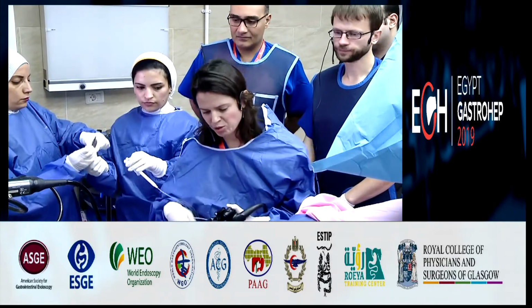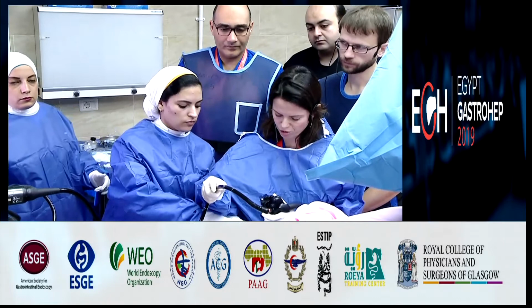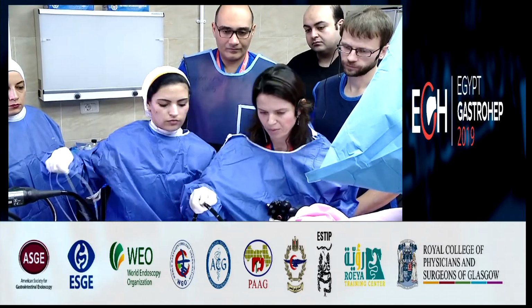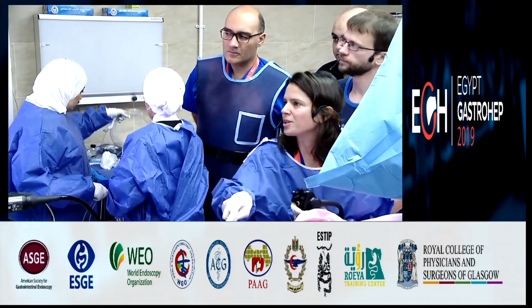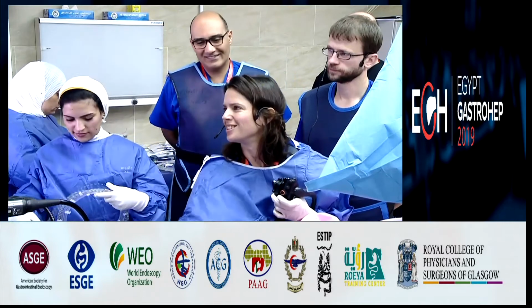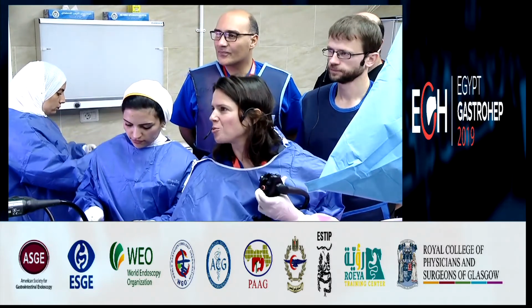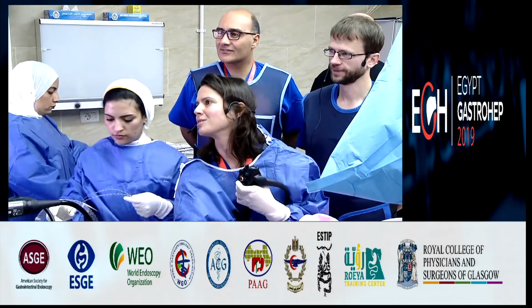So what we're planning to do here is we'll inject first to have a cholangiogram to see the anatomy. Sometimes getting the stent out is more difficult than the ERCP itself. It takes more time than the exam, huh? It happens to all of us. Usually we leave it for our fellows, but here it was a good exercise for me.